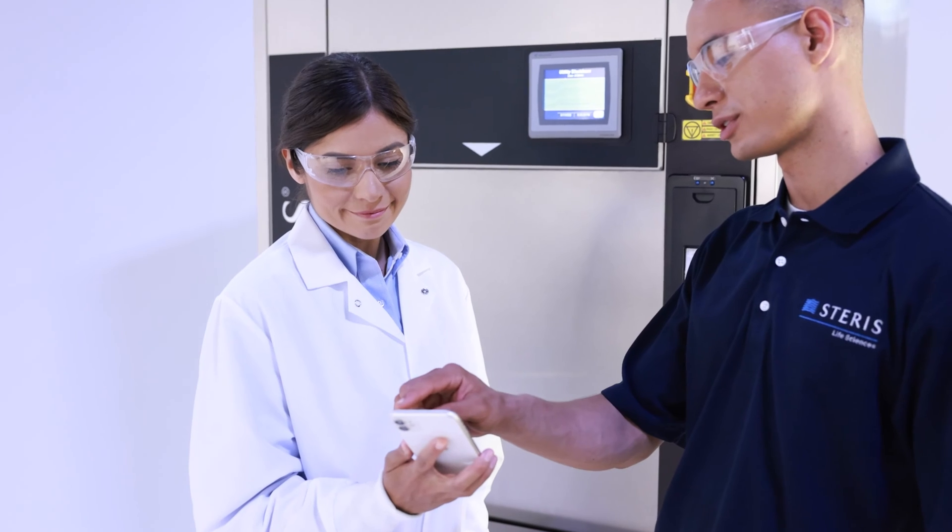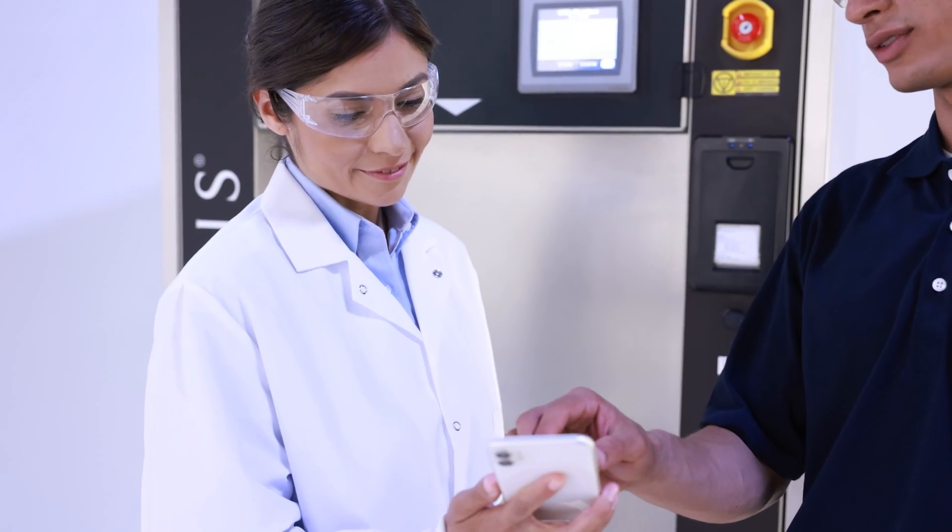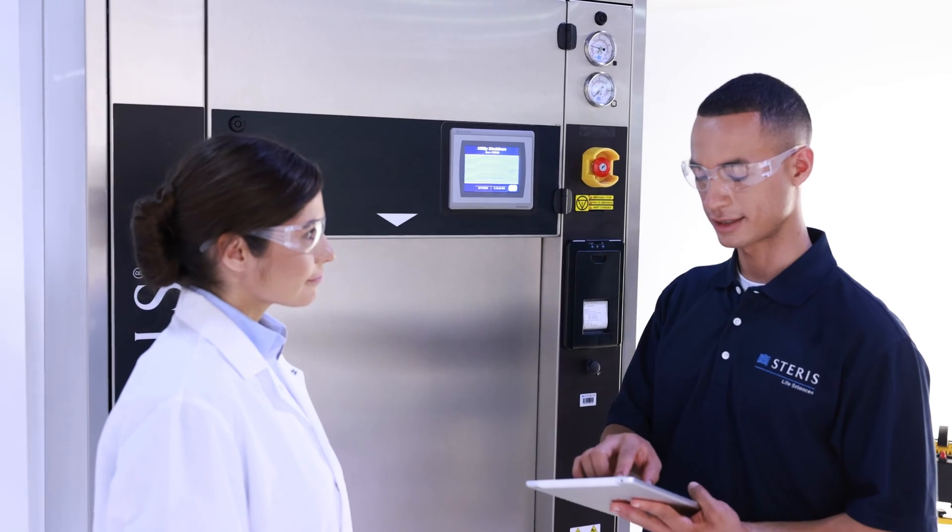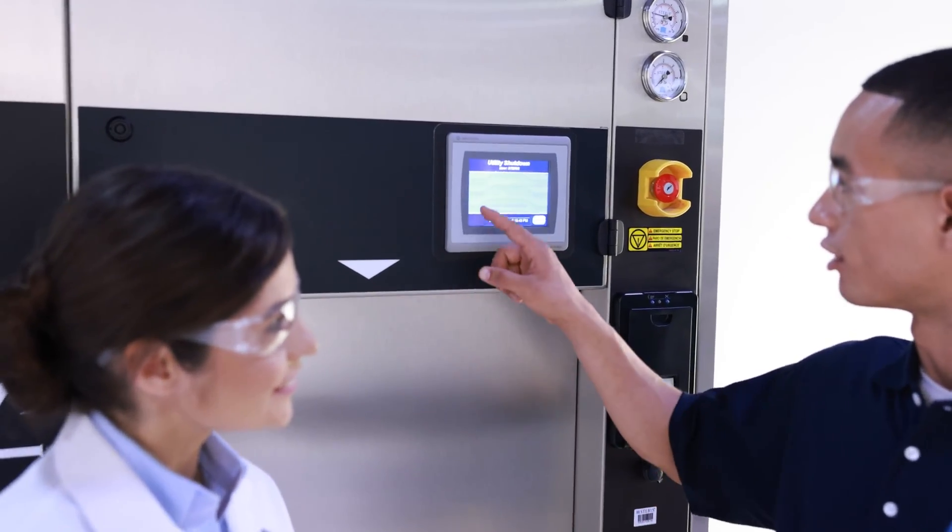Stay connected to what is happening in the laboratory with your AMSCO 600LS by receiving an email or text alert on the status of the equipment. In addition, the sterilizer can be interfaced with and monitored by your building management system.